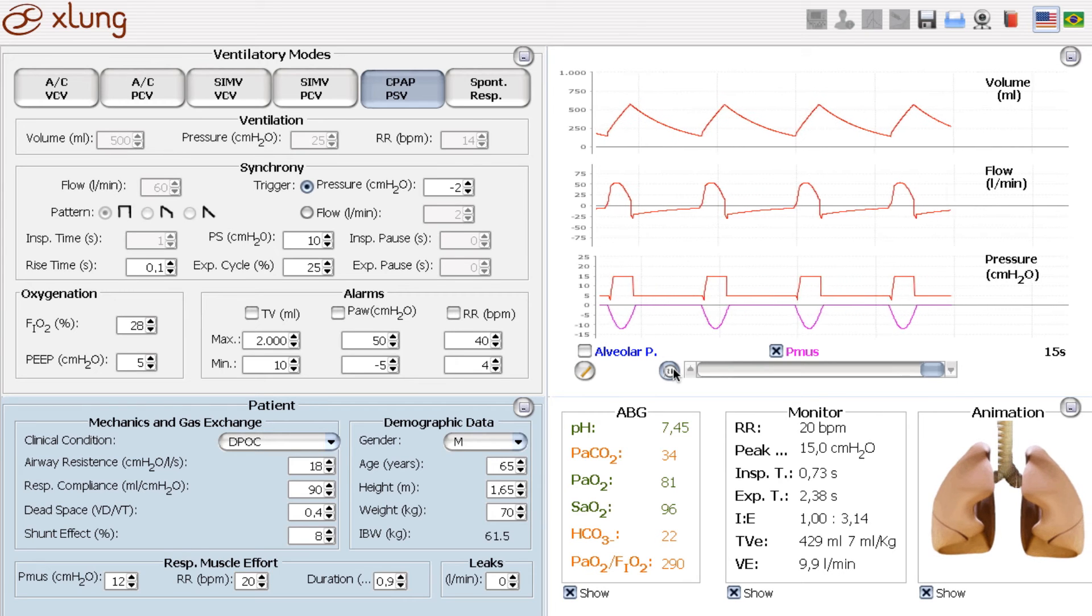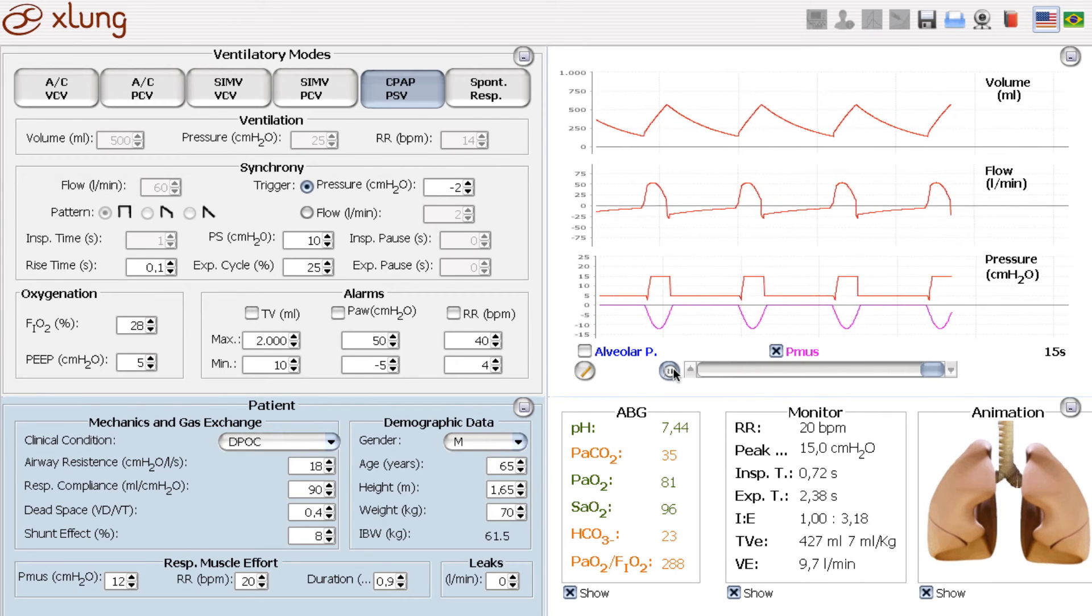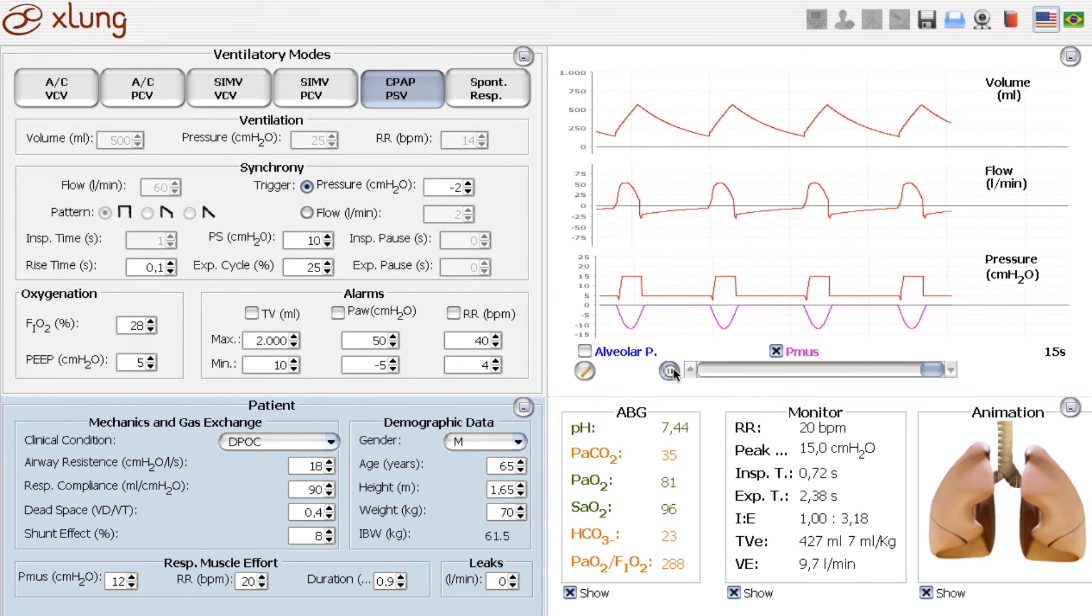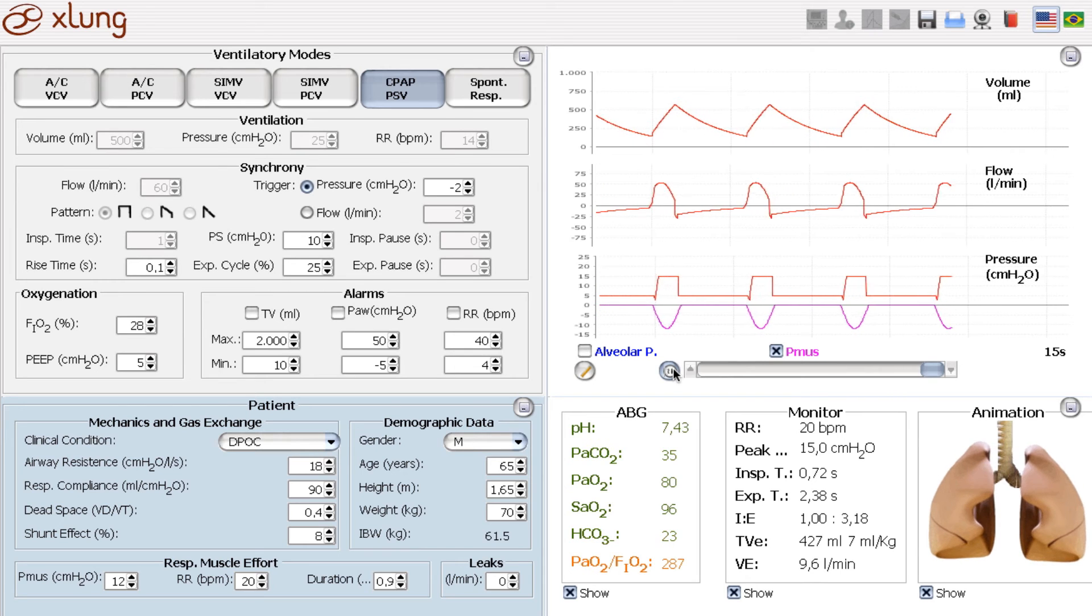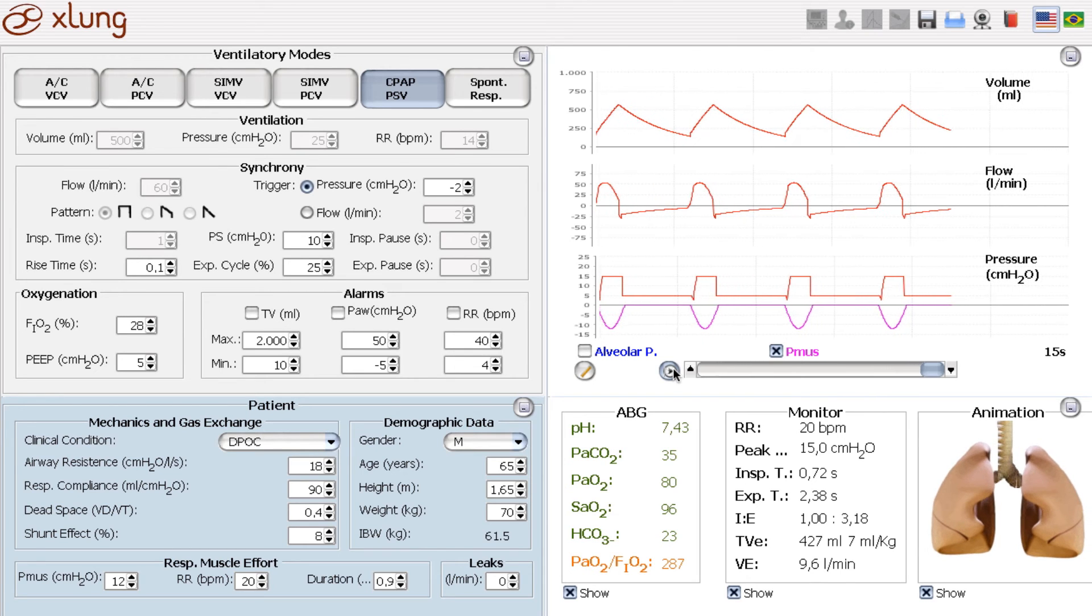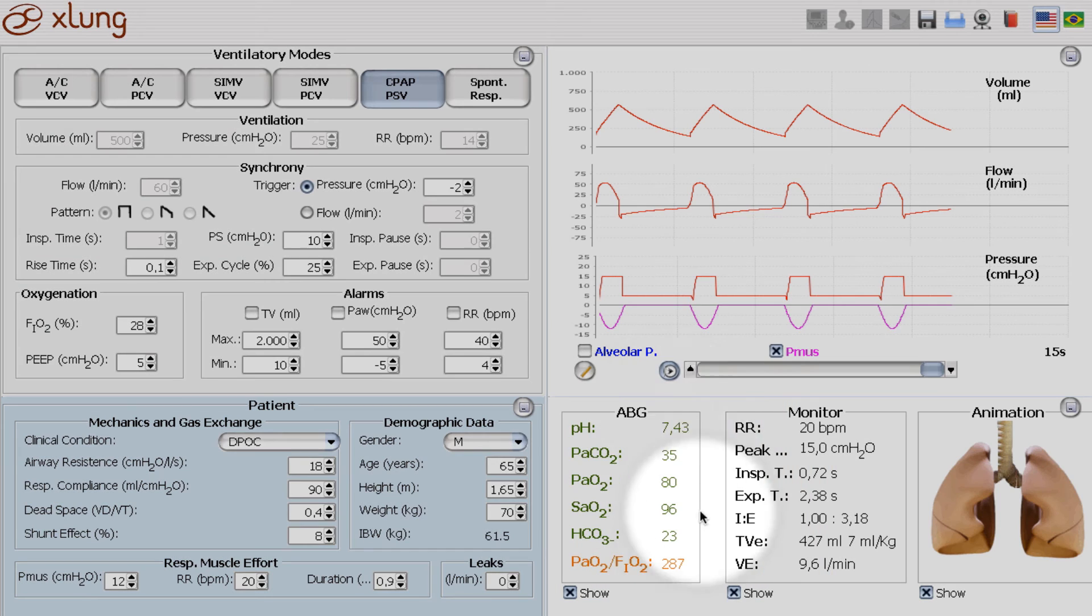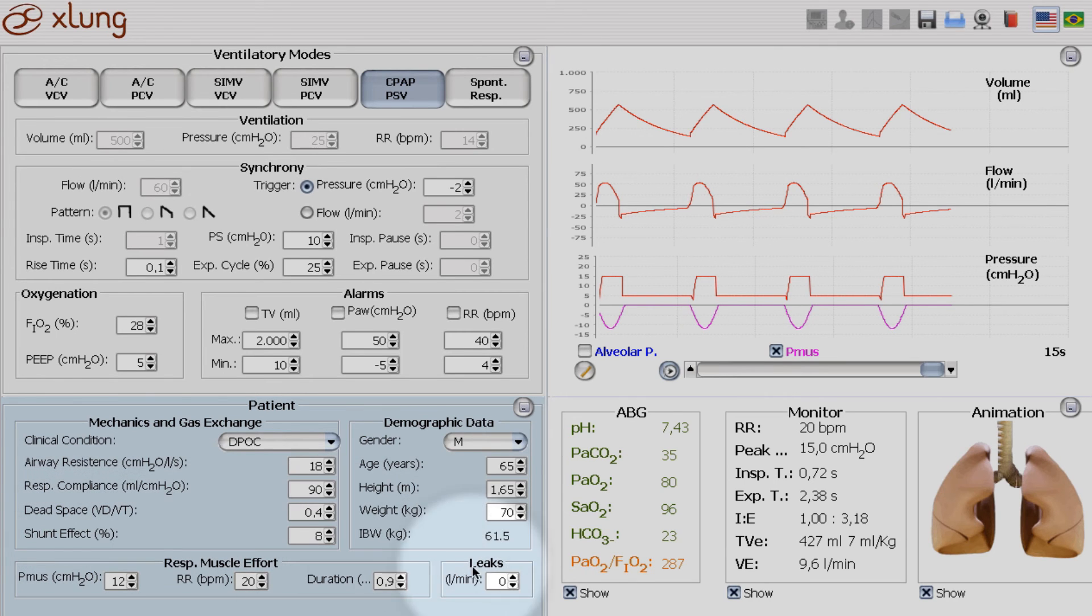Just because he is now on non-invasive ventilation. As we can see here, all parameters are green except for the PF ratio, which is reduced because of some shunt effect on the pulmonary parenchyma.